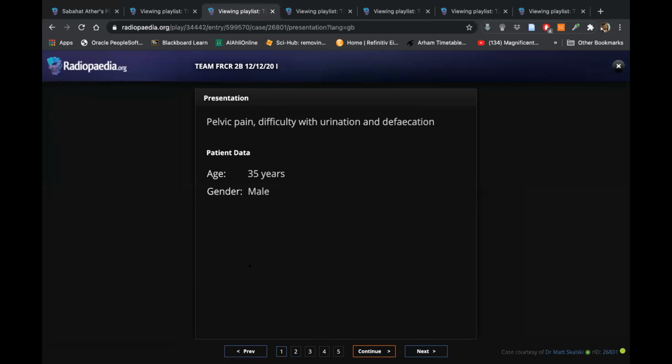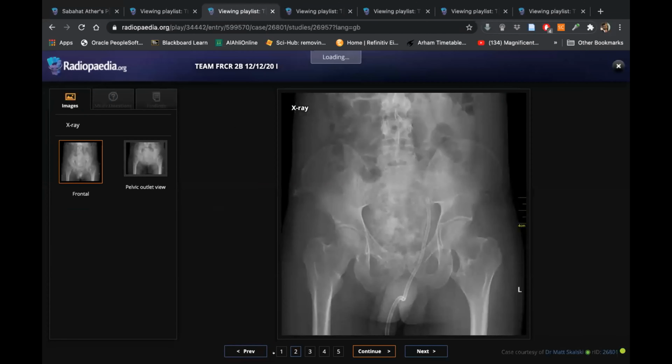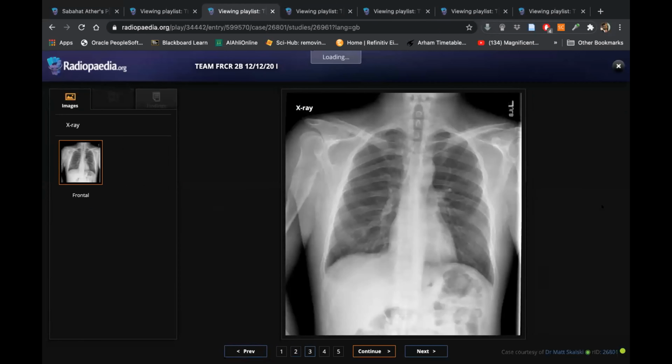Go ahead. Next case. Pelvic pain, difficulty with urination and defecation. Oh, sorry, this was supposed to be, I wrote that show X-ray number 3 first. Go ahead.